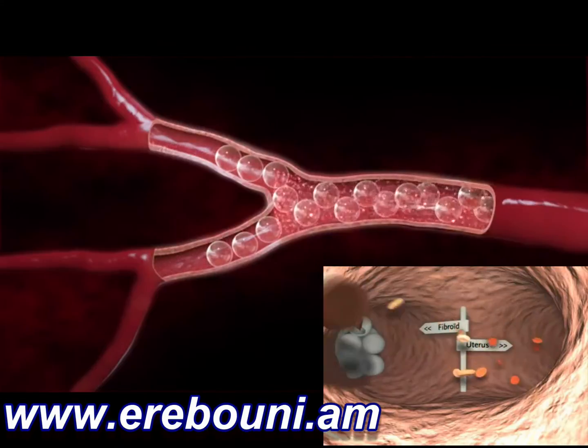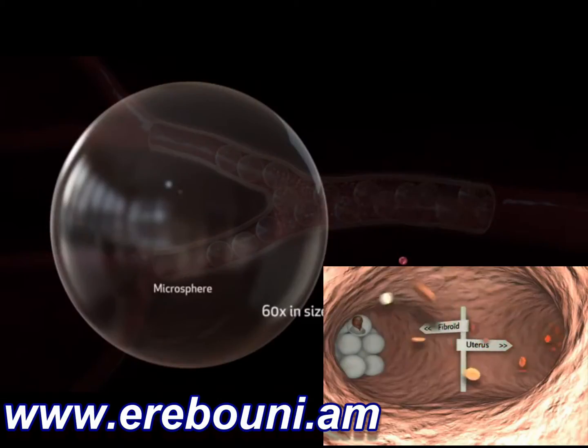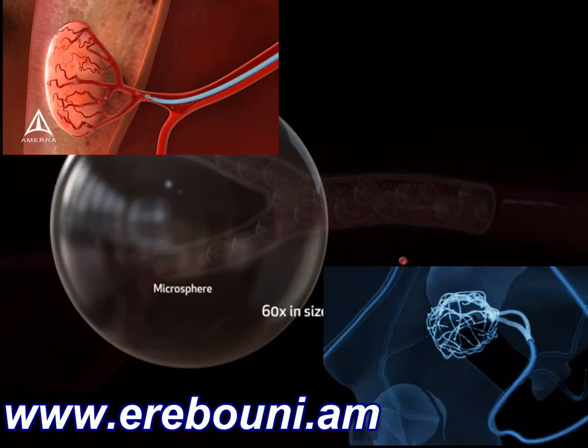The procedure is repeated in the uterine artery on the other side to make sure that all blood supply to the fibroids has been cut off. All fibroids are treated simultaneously.